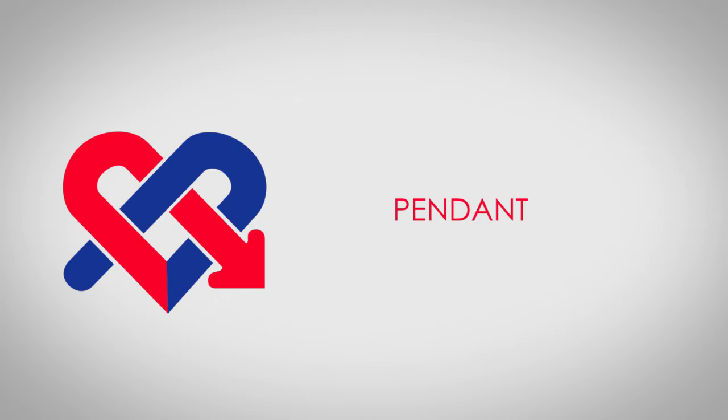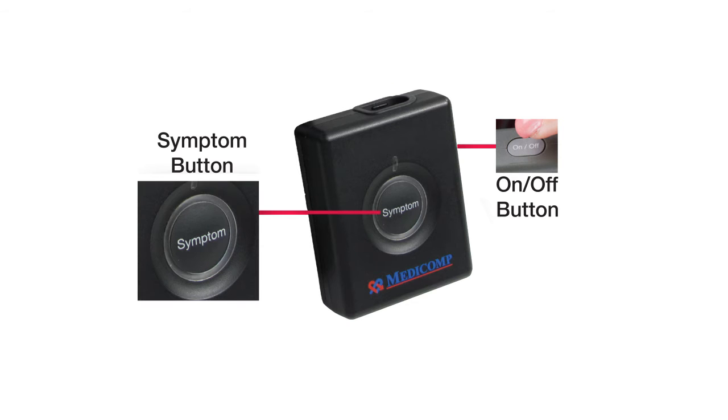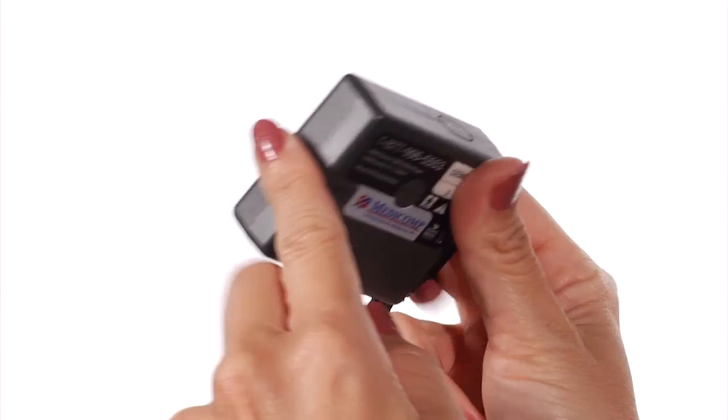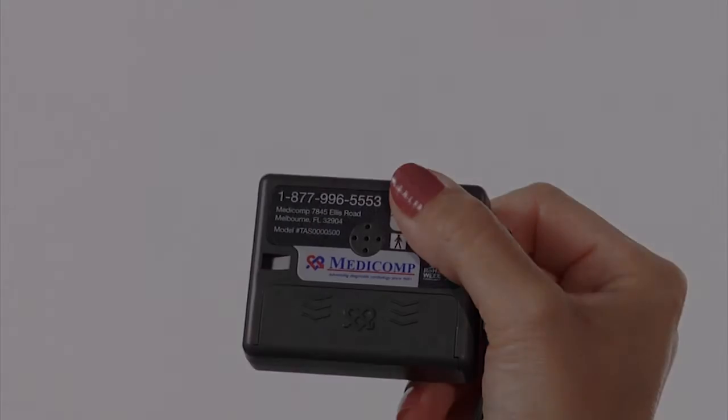Now let's become familiar with the pendant. The pendant has an ON-OFF button, the symptom button, patient cable connector, and lanyard hook. On the back, you'll find the battery compartment and the toll-free number to the MEDICOMP Cardiac Monitoring Center.